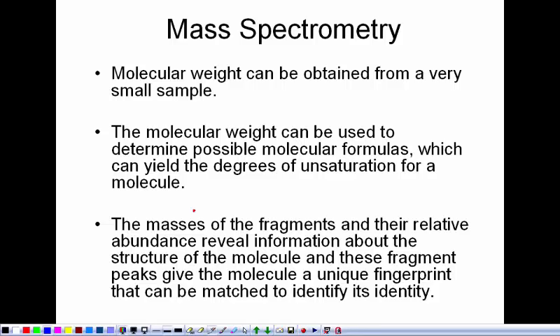So if you had to give a urine specimen and have it drug tested, it was most likely tested by GCMS. What they're doing is they're looking for metabolites from your system that occur when you take whatever illicit drug or steroid or whatever it is. You're going to get certain metabolites that come out, and that's what they're analyzing for.